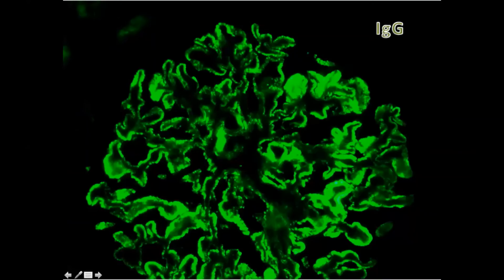All right, so this is the IgG, and I know that you guys know the diagnosis: this is basically a membranous pattern glomerulonephritis. We don't know if this is primary or secondary membranous. What we see is that the staining is along the loops, as if it were drawing them for us.